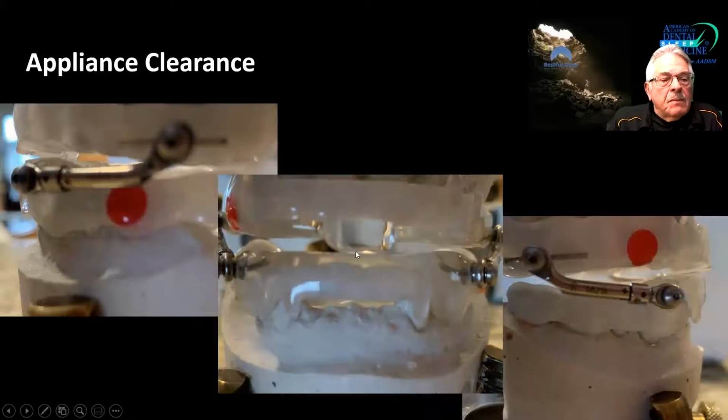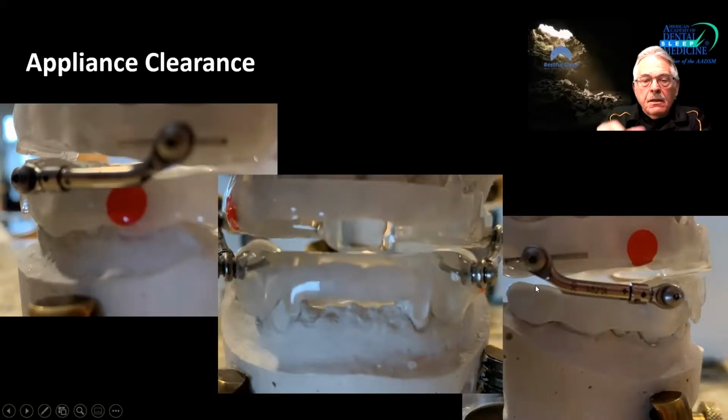This is a picture of the appliance. You can see the anterior midpoint stop here and no posterior contact. These pictures were a little hard to take, but you can get an idea here. Now you will notice here that unlike the anterior or the open bite registration, you do get the illusion that this is thinner, less space available in the back than the front.